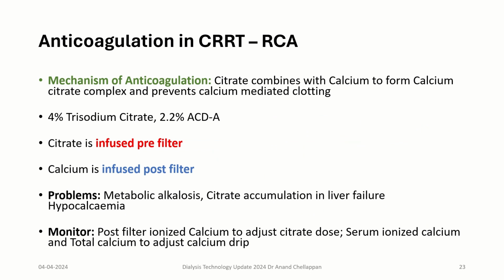Regional citrate anticoagulation. The mechanism of anticoagulation: citrate combines with calcium to form calcium citrate complex, and this prevents calcium mediated clotting. Calcium is an important factor which is responsible for the clotting of blood within a dialyzer.